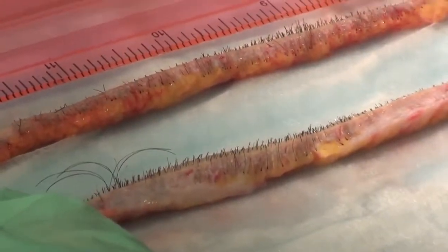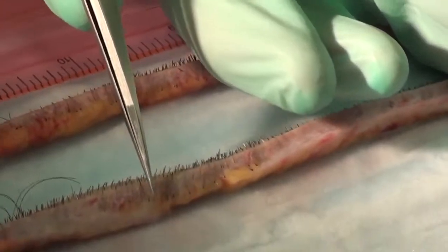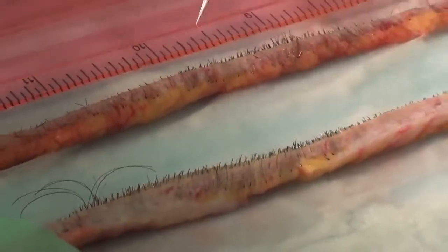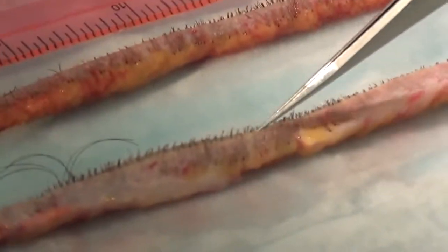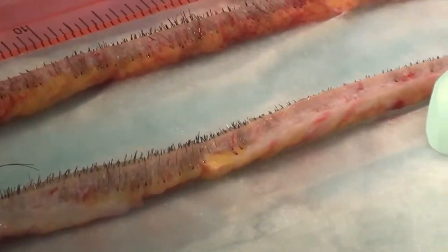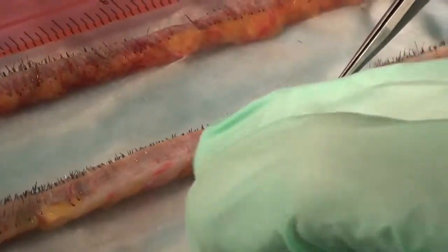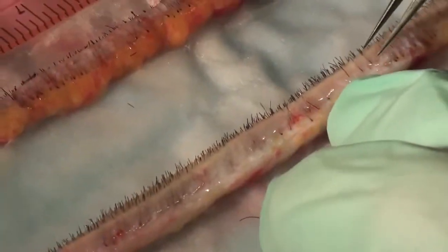So even with this scar in place, let's take a look at how we did here. It's nice and clean. You can see all these hairs are nice and intact, where the bulb goes from the bottom to the hair follicle all the way out to the skin. Everything's nice and clean and intact. Now when we go through the scar, you can see once again very little transection because there's no hairs in the scar, so everything's nice and clean the whole way through.